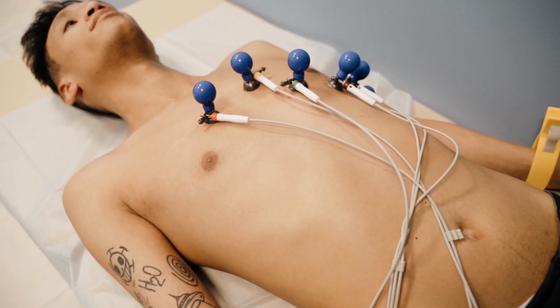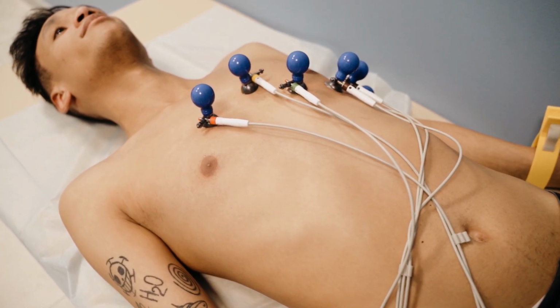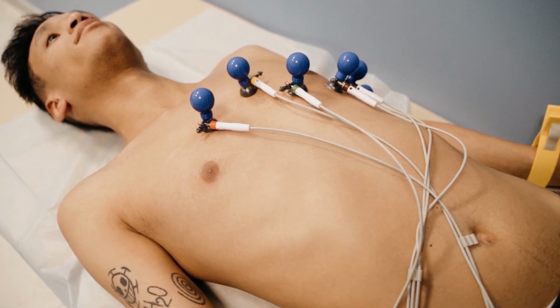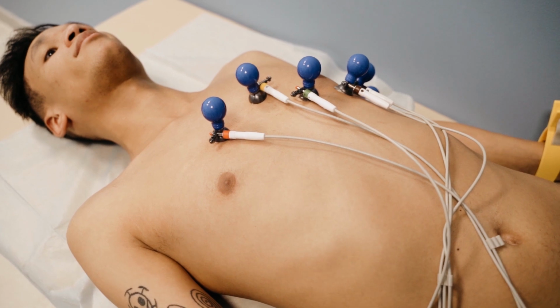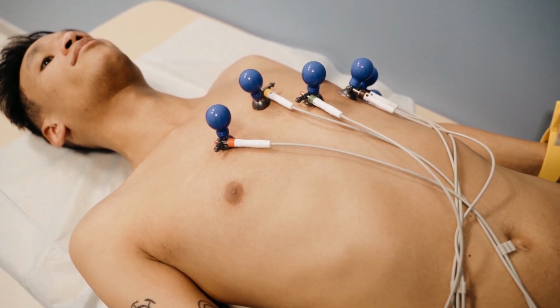The next one will be headgear. Wearable devices like smart helmets or headbands are used for brain wave monitoring or concussion detection. The next in this category is wearable patches. These are adhesive patches with embedded sensors that can be applied to the skin for continuous monitoring.